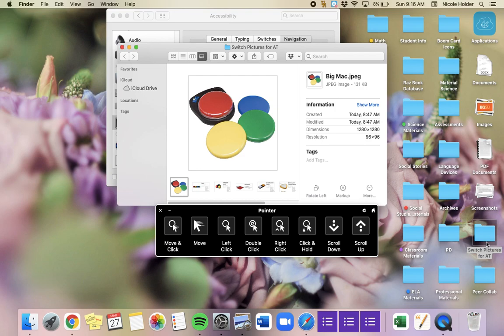We also did more than just use these for his means of communication. We hooked these up to a boombox. He's really motivated by music, specifically classic rock. We hooked it up to the aux cord output, and we also have an interface that we hook the Big Mac straight into, and then the interface connects to the boombox.